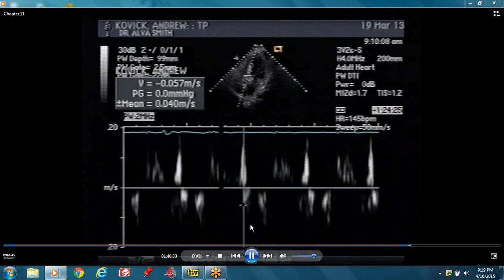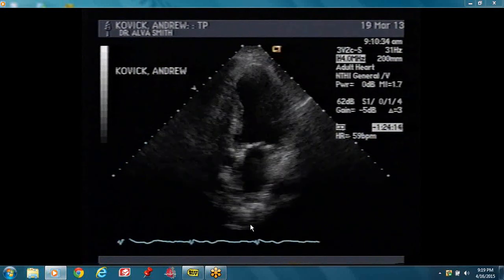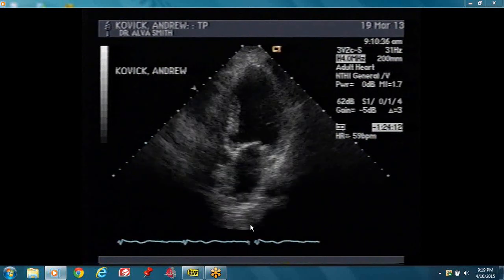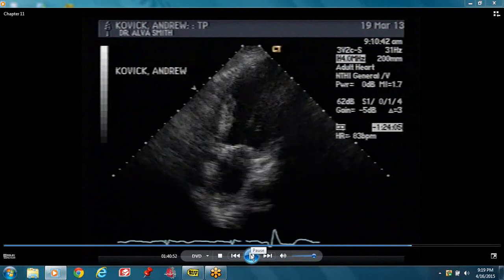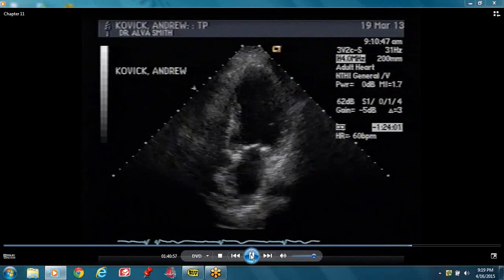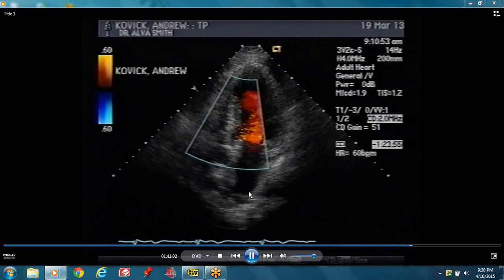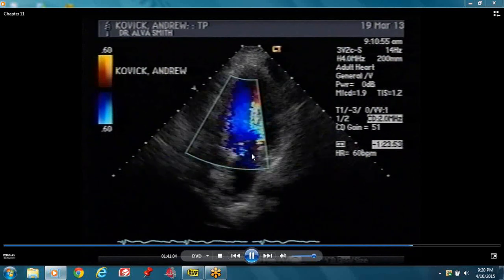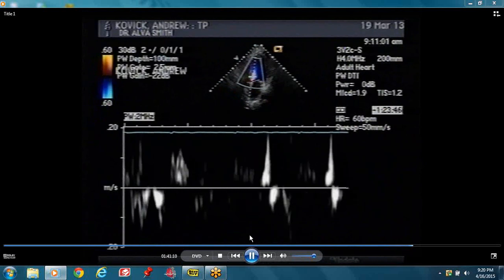You get an E prime of 6 centimeters per second — that will be low. If the E prime is 6 centimeters per second and the E was smaller than the A, that could only be type 1 diastolic dysfunction. There's a little bit of mitral regurgitation — you can see the color coming back there.